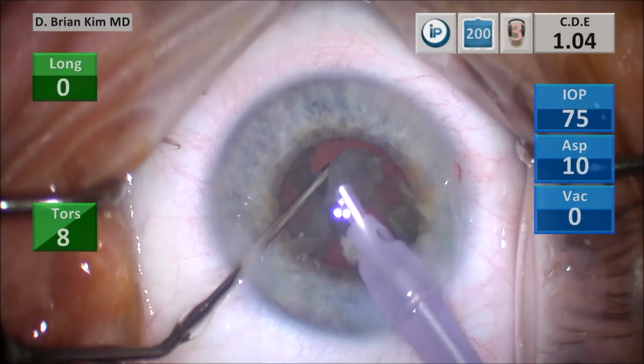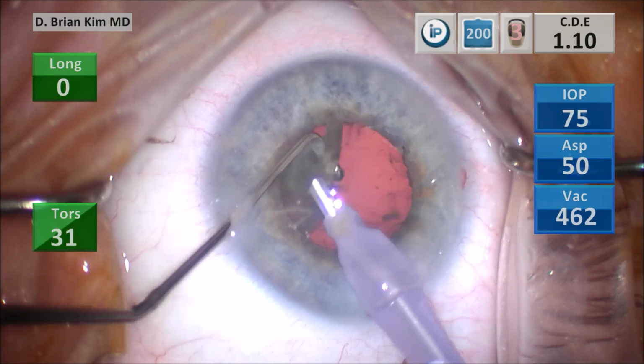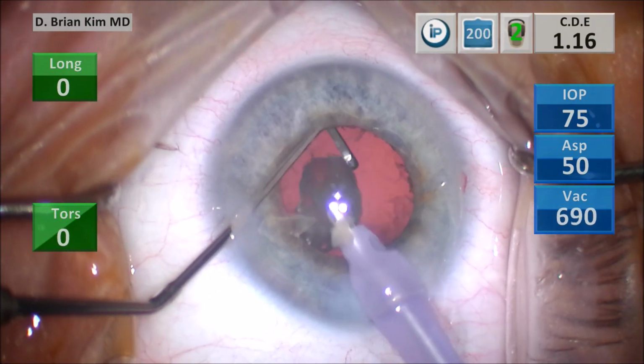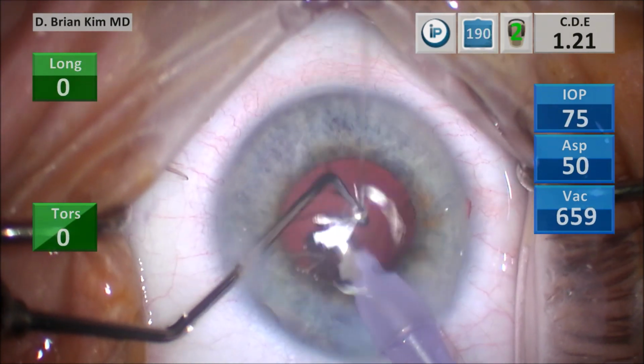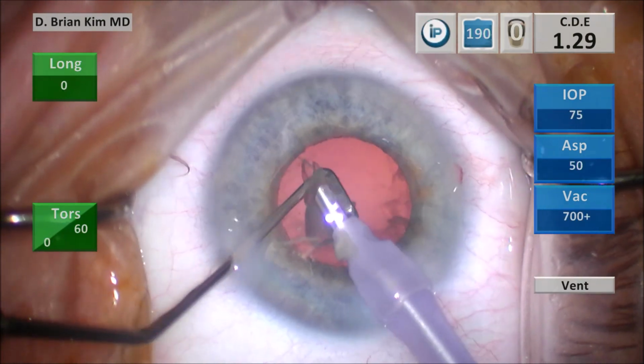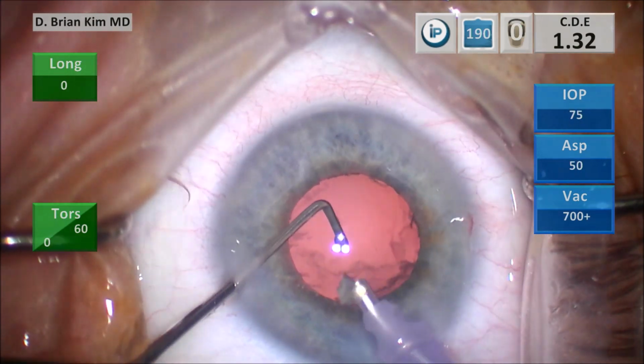And again, I'm being careful when I'm applying that vacuum. You don't want to apply the vacuum during the crush. You want to crush it first, and then you place the chopper deep, and then you activate the vacuum, and you do it this way to protect the posterior capsule. Now all the endonucleus is essentially removed.